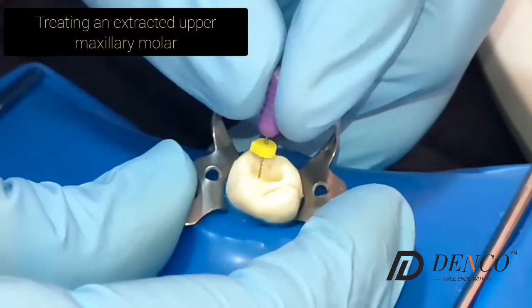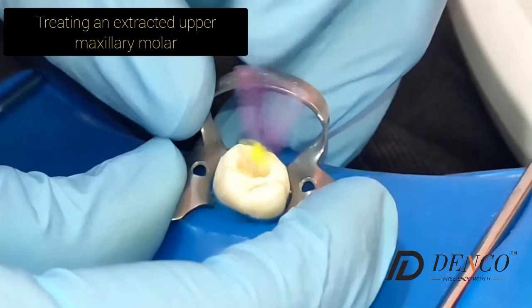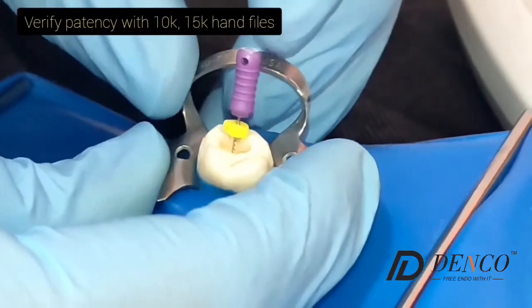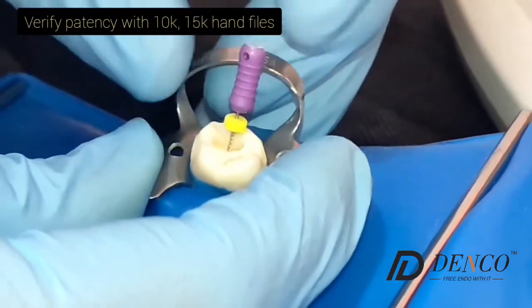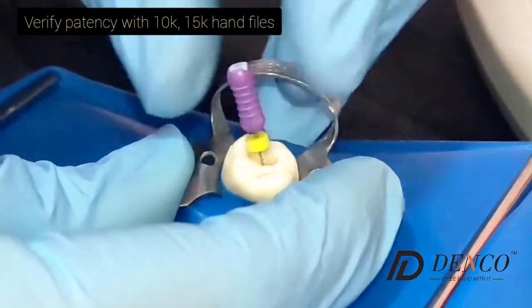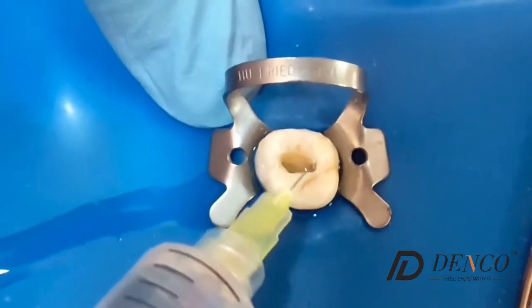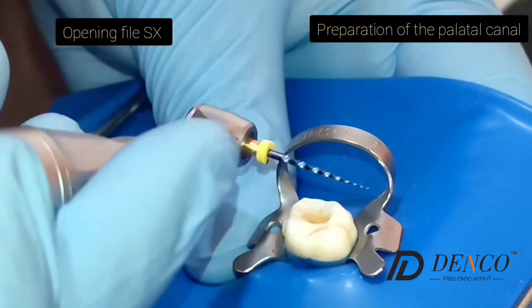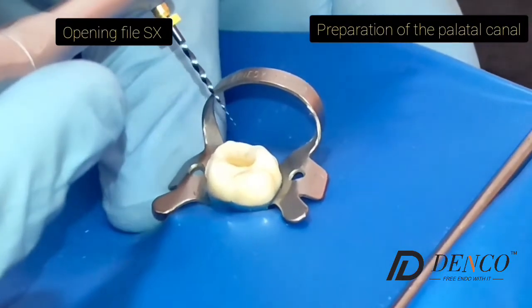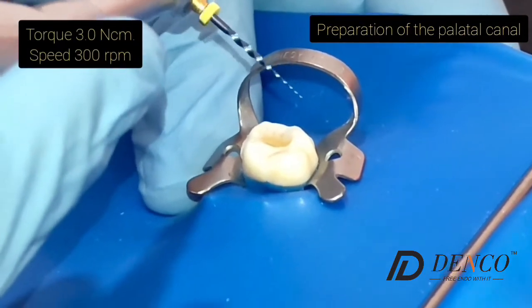First, we probe the canals with a number 10 file, like this one — it can be NiTi or K files, classic stainless steel K files — to probe the canals and verify the patency of the canals. We irrigate the canals after each file. This is the opening file of the Superfiles 3 from Denco, used to shape the coronal part of the canal. We use it at 300 RPM speed and torque 3.0.